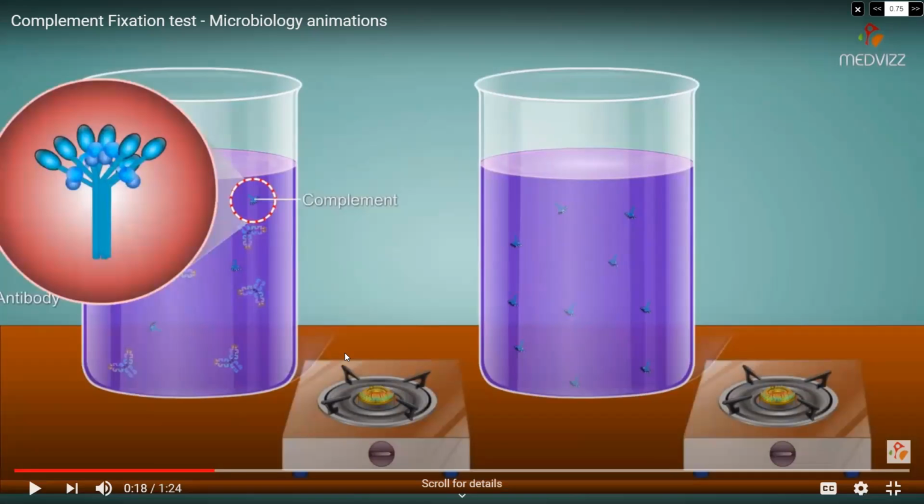Here you are trying to find out how well that complement is fixing to that antibody, ठीक है. Whenever antibody and complement reaction occurs, that will go and attach to the antigens of a pathogen and it will help in killing the pathogen, ठीक है. Now if you guys are having doubts, please feel free to ask, because this stuff can get a little confusing, any of these tests, okay.